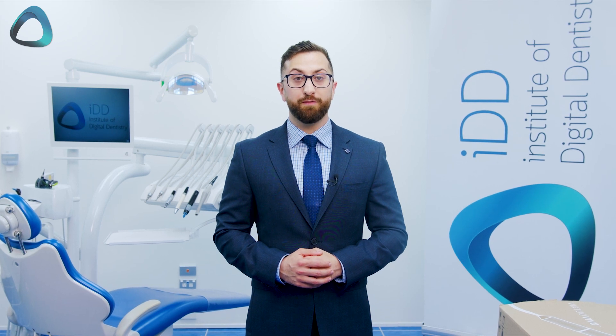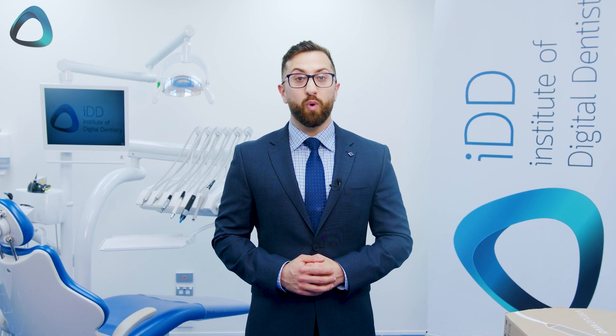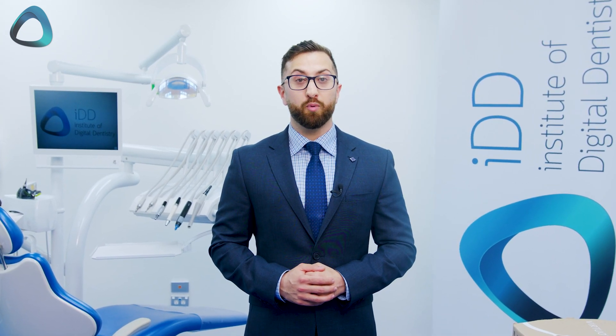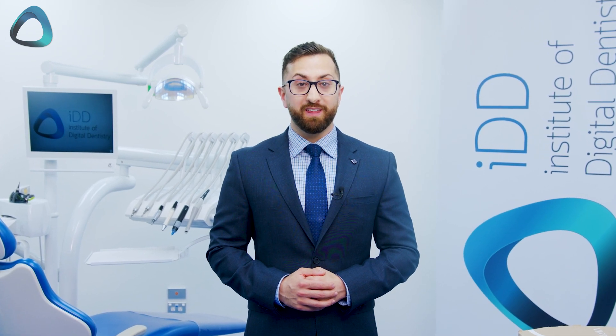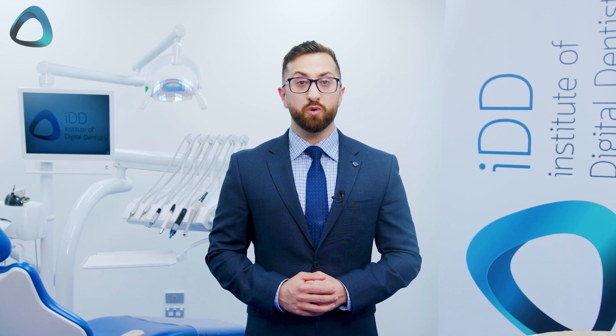Do you want to know what you get when you buy a Virtuo Vivo intraoral scanner in 2022? Are you wondering if it has changed since 2019 when I personally gave it a pretty low rating in our review? We will cover that in this unboxing of the new 2022 version of the Virtuo Vivo.